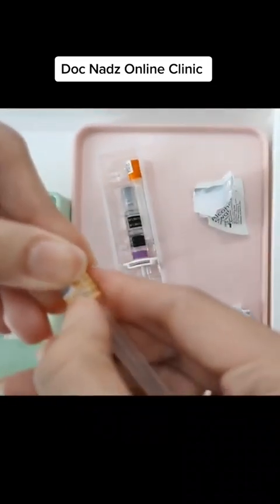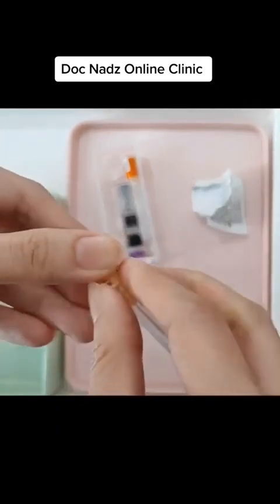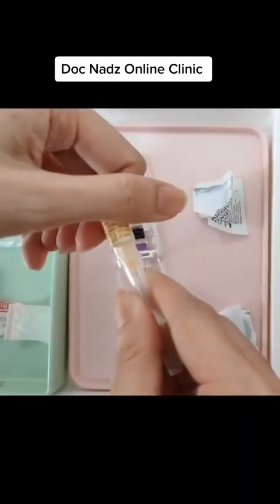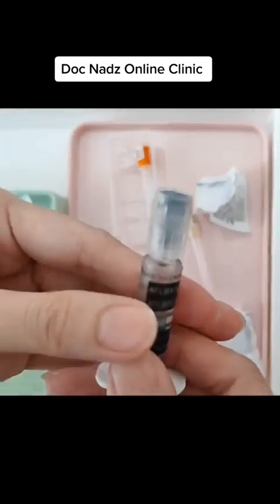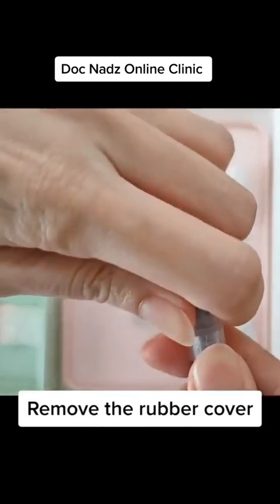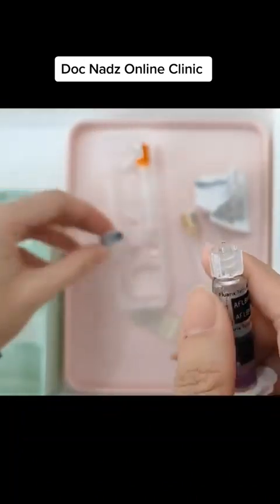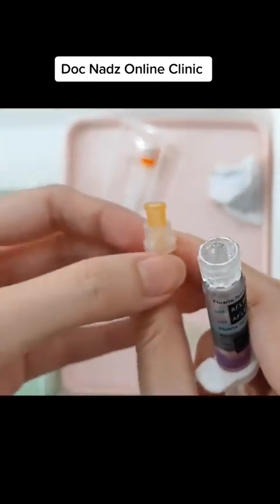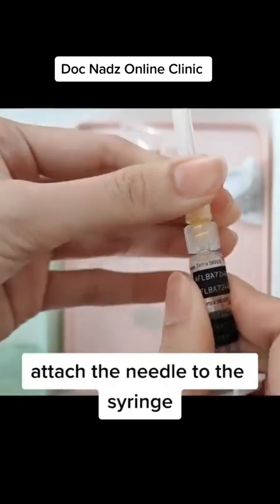We will peel off the sticker to open the needle container. Remove the rubber cover of the syringe. Attach the needle to the syringe and close it tightly.